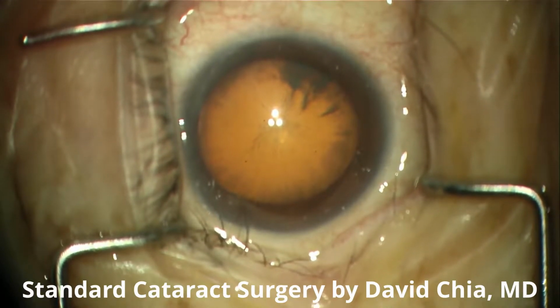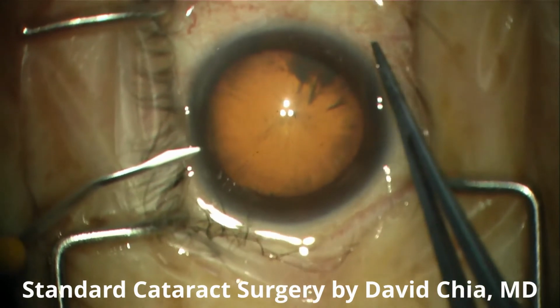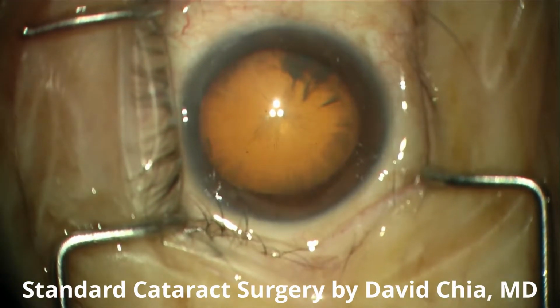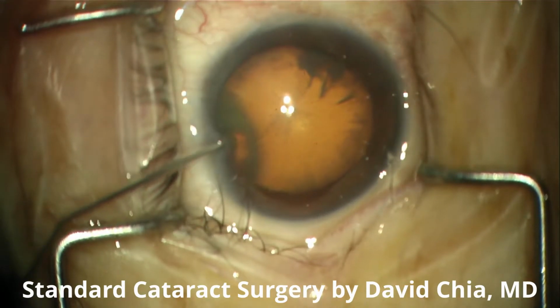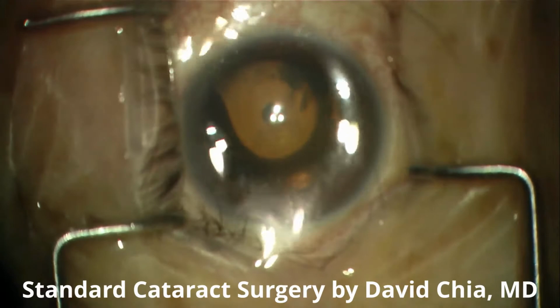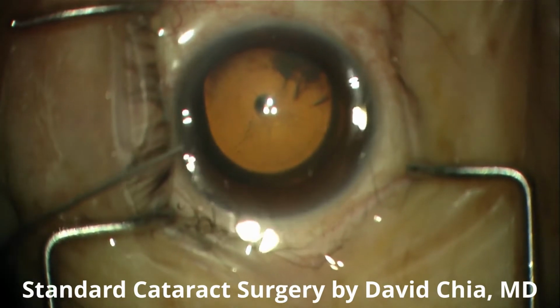In this video, we're going to be showing you a minimally edited, narrated video of a standard cataract surgery. First you see the creation of a 1mm paracentesis. Next you see the injection of 1% non-preserved lidocaine into the anterior chamber. There's already been proparacaine and usually lidocaine gel used for anesthesia.